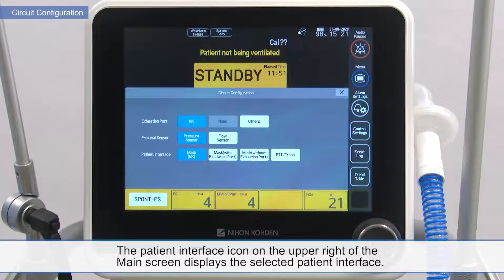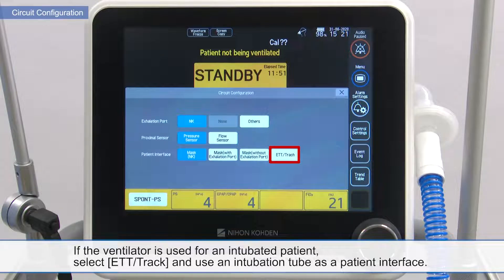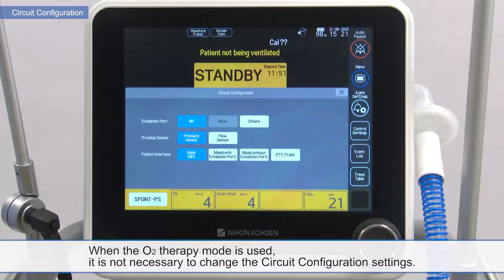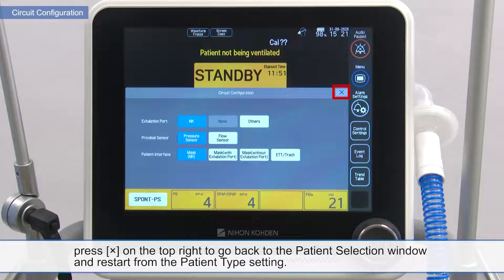The patient interface icon on the upper right of the main screen displays the selected patient interface. If the ventilator is used for an intubated patient, select ETT track and use an intubation tube as a patient interface. When the O2 therapy mode is used, it is not necessary to change the circuit configuration settings. Once the circuit configuration settings are completed, press X on the top right to go back to the patient selection window and restart from the patient type setting.